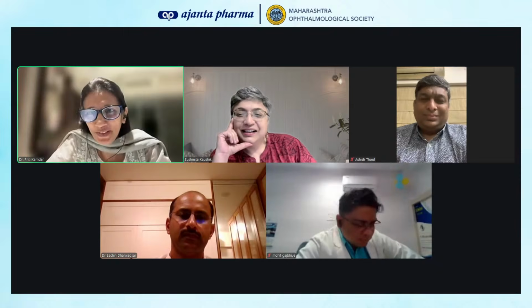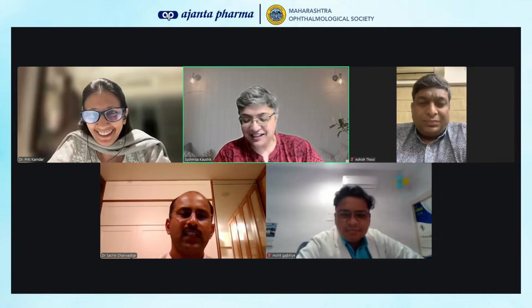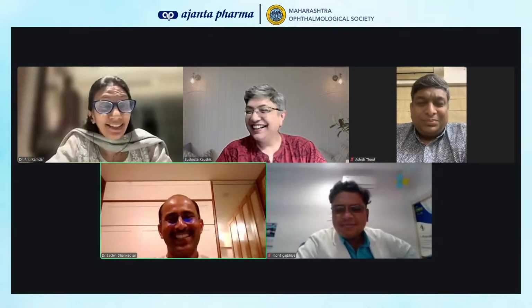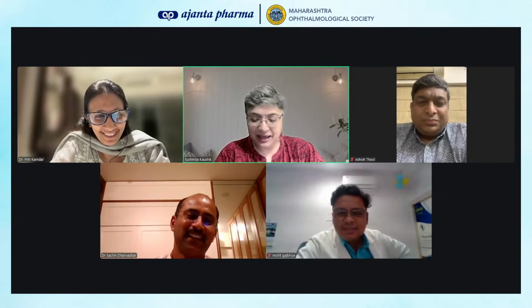All right, Dr. Sushmita, I know you are saying Sarkari, so whatever the Sarkar is giving. We have both the Spectralis, it's just that our clinic has the Humphrey. Don't go by the word Sarkari, they have everything. No, I said the Sarkar has given everything, but since we have the Humphreys, we like the Cirrus.